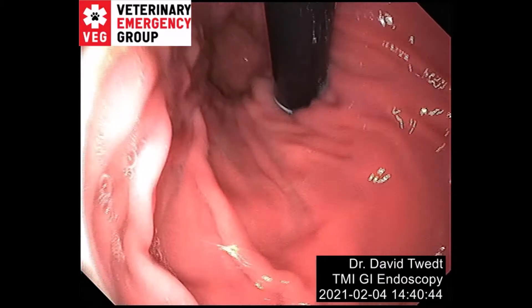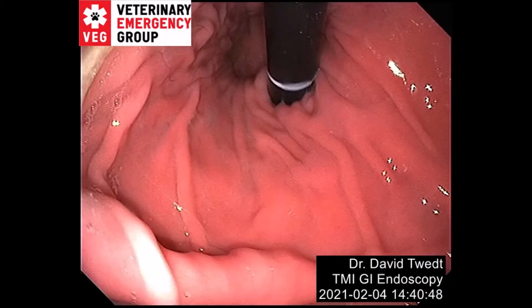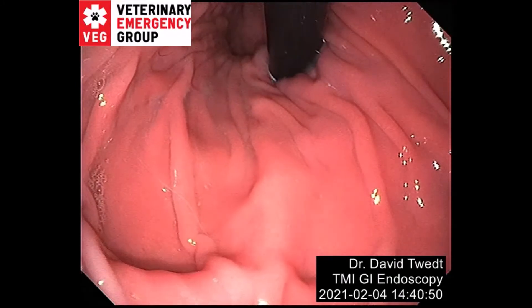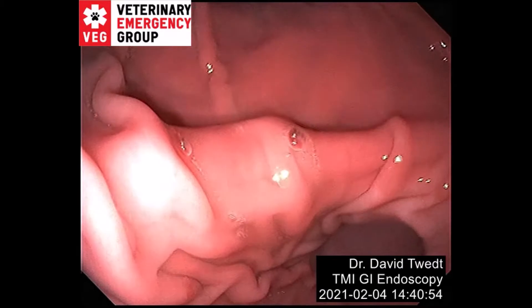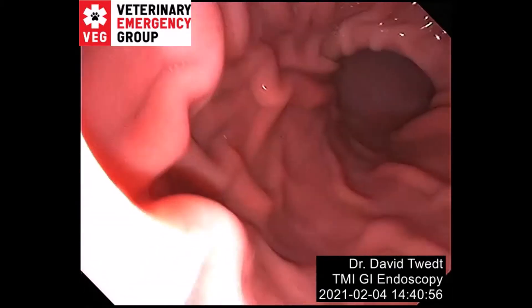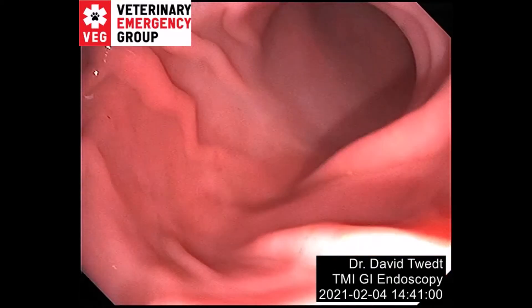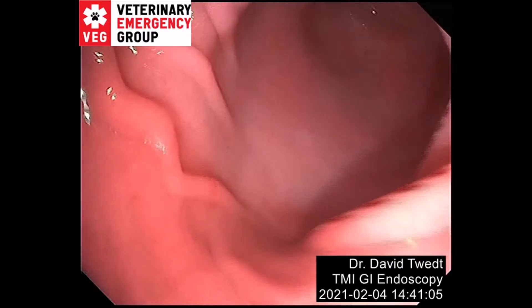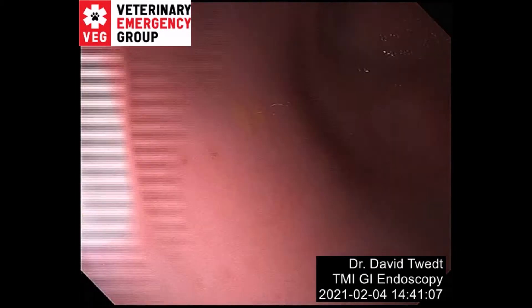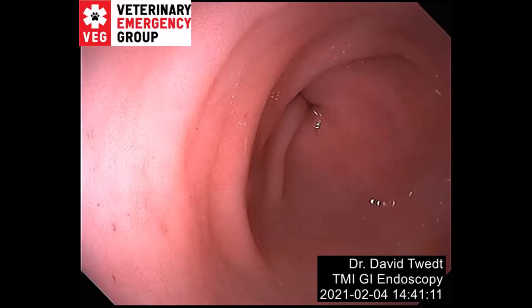If you get to here and realize you've gone too far, you need to now look down — big knob forward — and there's the entrance to the cave. Move forward, getting a little resistance, you might get a little paradoxical movement. Push through that into the cave, and at the end of the cave, there's your pylorus.